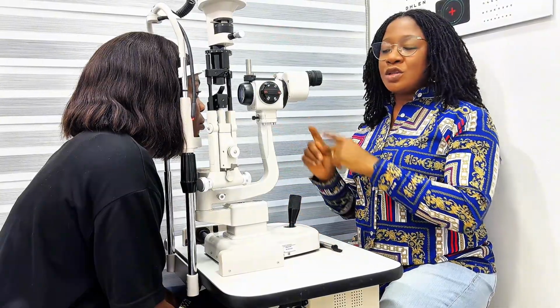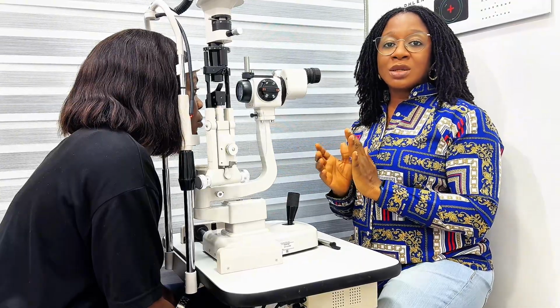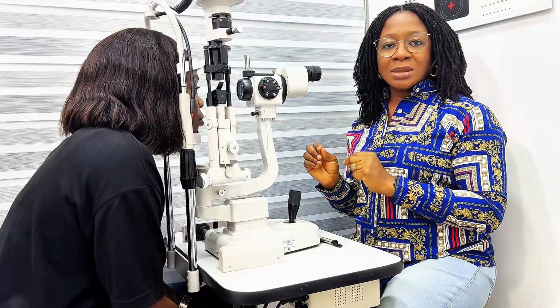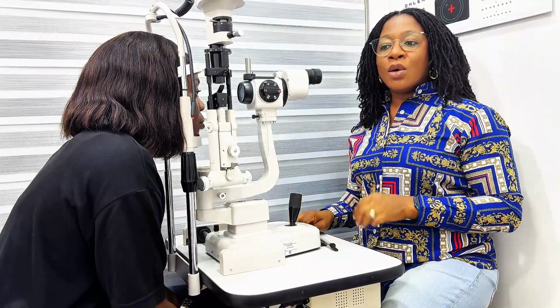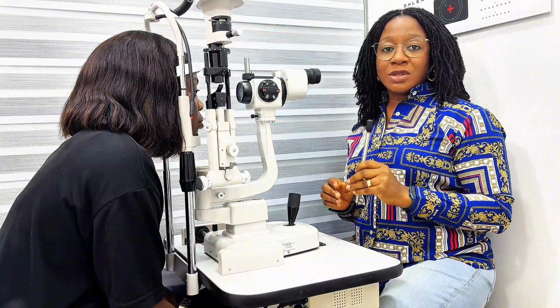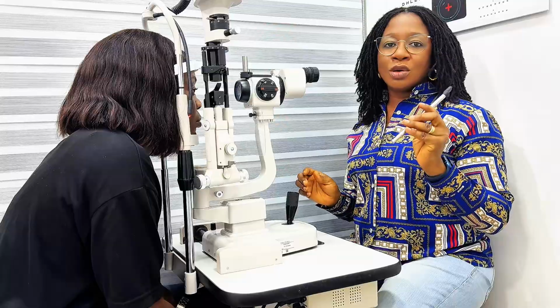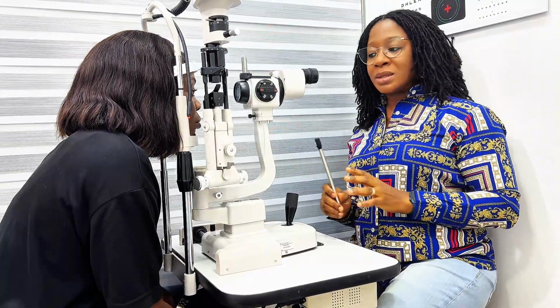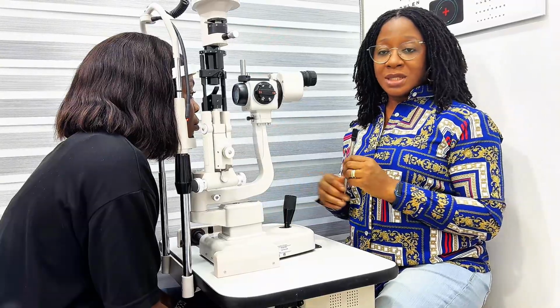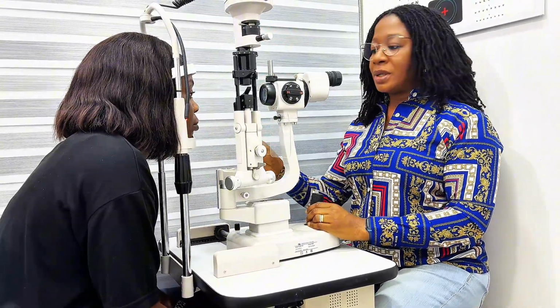You can use your patient's nose, the bridge of your patient's nose, or your patient's closed eyelid to get this slim width, or you can use this focusing rod. For the purpose of this video, I'll be using this focusing rod to show you how to get your narrow beam. Remember that we use the narrow beam for the optic section, and we also use that narrow beam for the Von Herick.